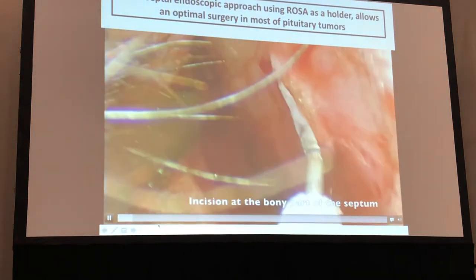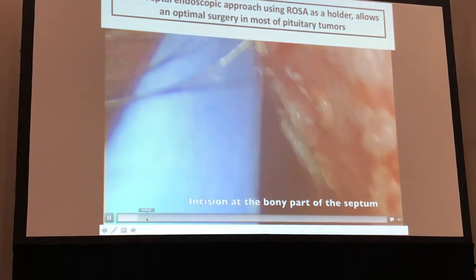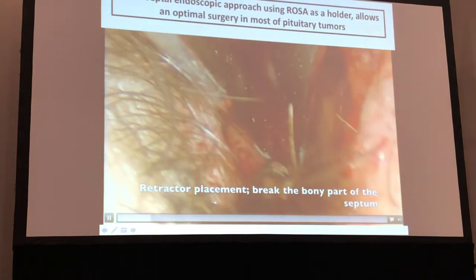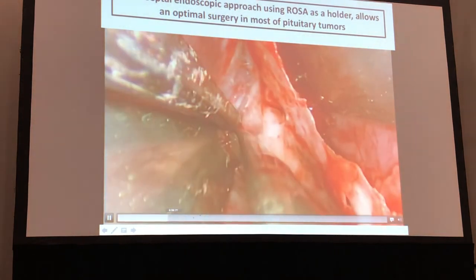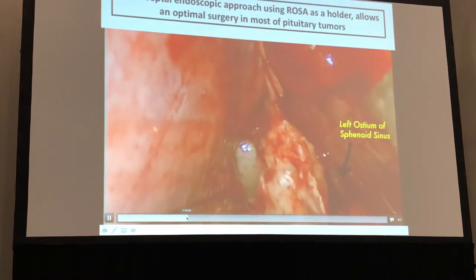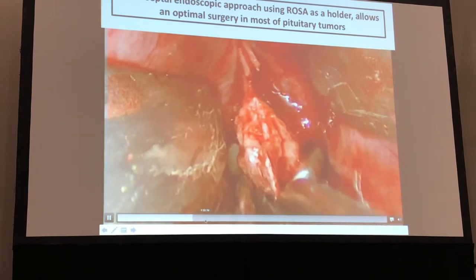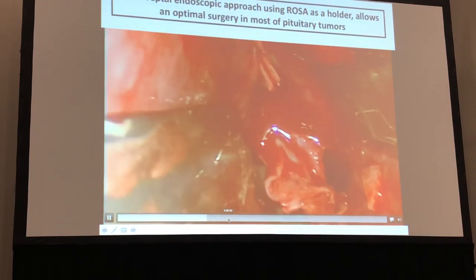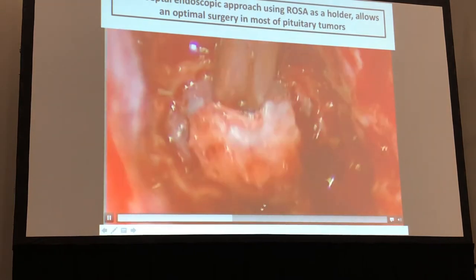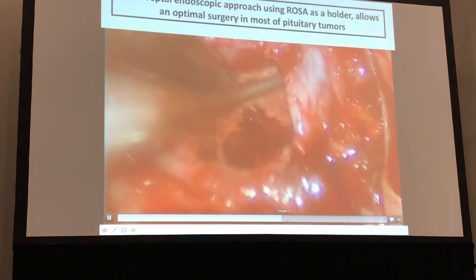So that's the nasal cavity being inspected. So we make a small incision on the nasal septum, and we create a tunnel. And this is all done using robotic endoscopic assistance. And we retract it gently, and then we go down right up to the keel of the vomer. So fundamentally, it's like a microscopic transseptal approach, but you're using an endoscope and the opening is much less. So removing the keel of the vomer and exposing the sphenoid sinus and opening the sella as a plate, and that could be replaced at the end. Removing the tumor.